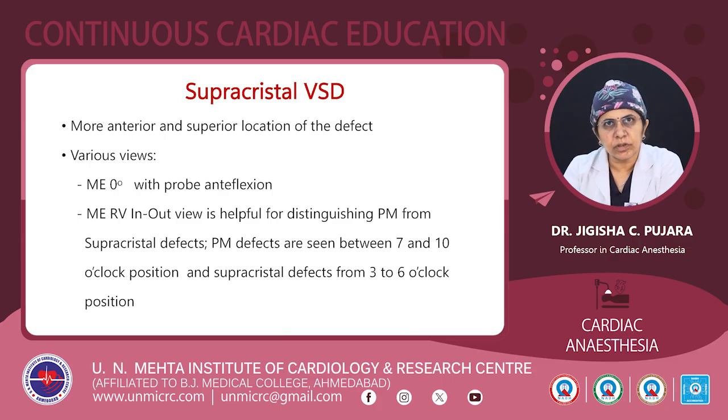Sometimes a perimembranous VSD has an outlet extension. So you can see here both positions, 3 o'clock to 6 o'clock and 7 o'clock to 10 o'clock. There are two different flows of the color jet in this view. This suggests that when it is a perimembranous VSD, the surgeon should look for the outlet extension of the perimembranous VSD as well.